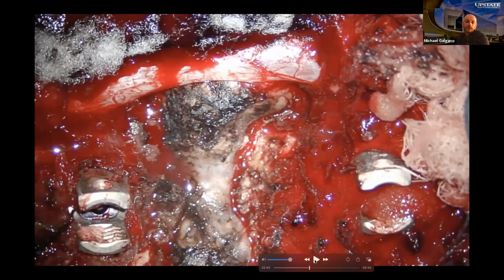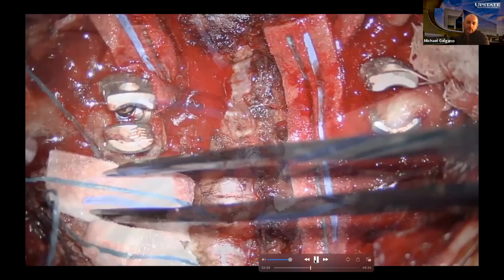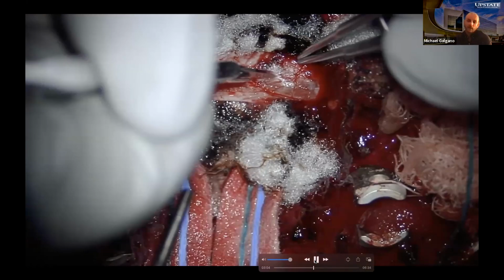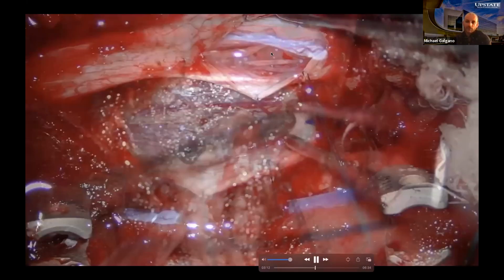So I like to try to treat these almost like a meningioma, as the neurosurgeons here would know. I've done several of these. We kind of pack the outskirts of the tumor here. After I did that, I brought the ultrasound in to see if there was anything. It's very difficult to tell, because the epidural part went ventral to the spinal cord here. And we could see there was a tiny, small tumor, which you could see right here, which was coming off one of the thoracic nerve rootlets.